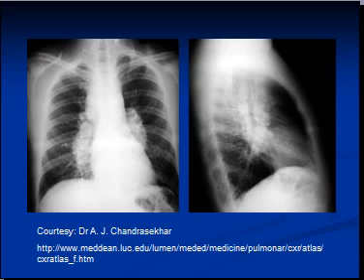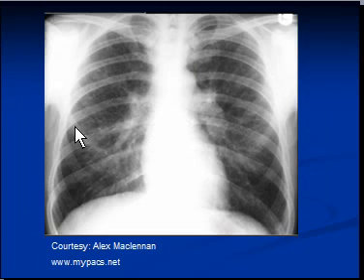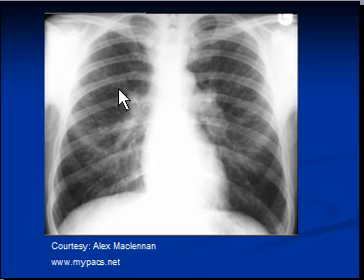Sarcoidosis can have three stages. Stage one involves lymph nodes only. Stage two involves both lymph nodes and lung parenchyma. The lung parenchyma, as shown in this X-ray, will show a reticular pattern, which means a net-like shadowing.